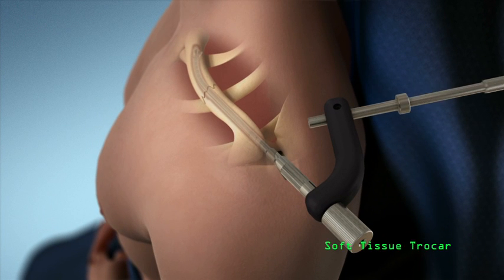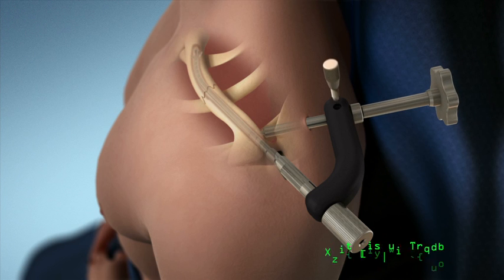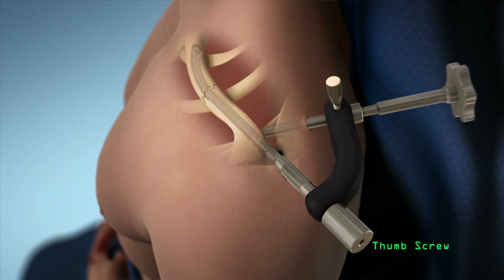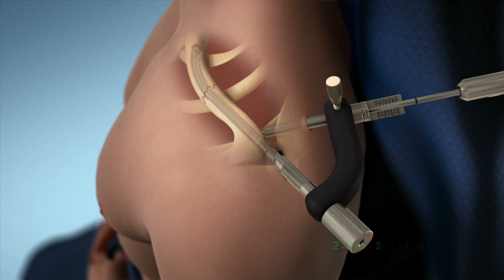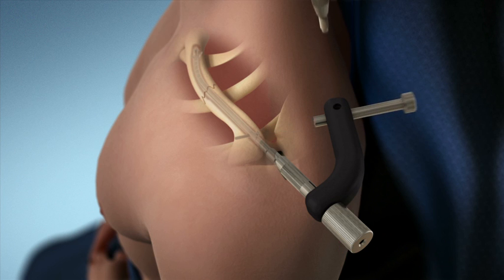Insert the soft tissue trocar and external sheath through the outrigger until it is firmly against the posterior bone. Lock the position of the external sheath using the thumb screw. Insert the 2 millimeter drill guide and drill through the implant. Select the screw length indicated by the drill guide. Subtract 2 millimeters for countersinking. Then insert the screw using the 2.5 millimeter hex driver. Detach and remove the outrigger and close the incisions.